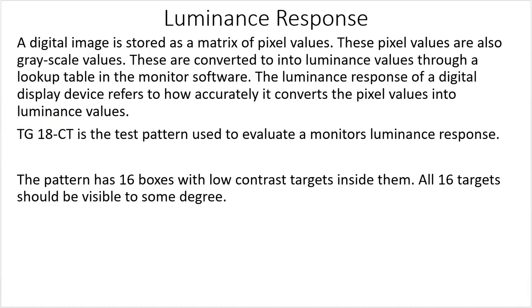The pattern has 16 boxes with low contrast targets inside them. All 16 should be visible to some degree. And CT is just what they named it. It has nothing to do with CAT scan.